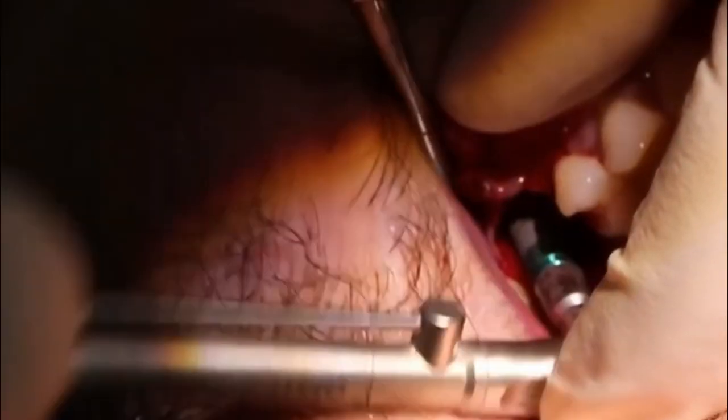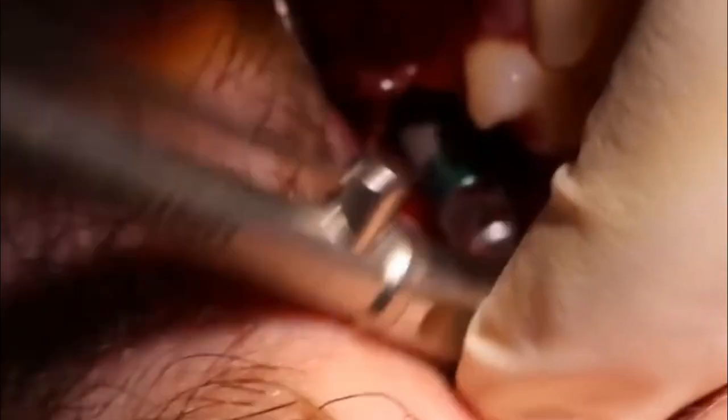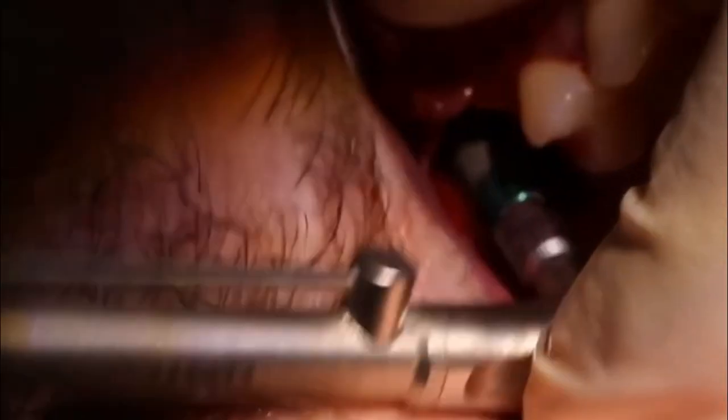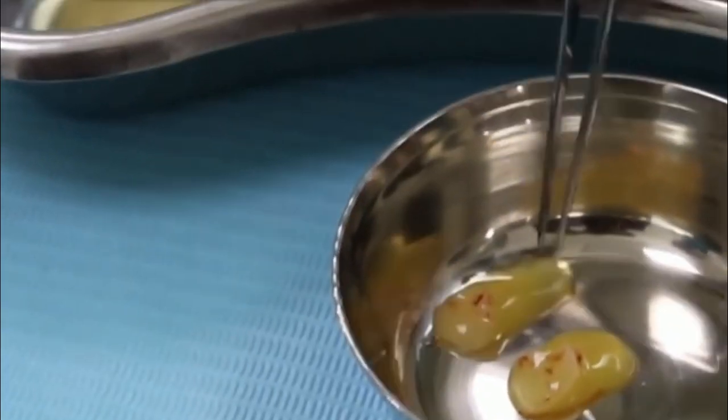As you can see, the buccal bone is lost in this case, which is why we raised the buccal flap fully. Otherwise, raising the buccal flap is not necessary and it is better if it is not raised in immediate molar implant cases.